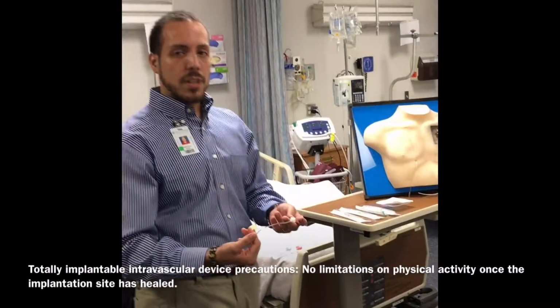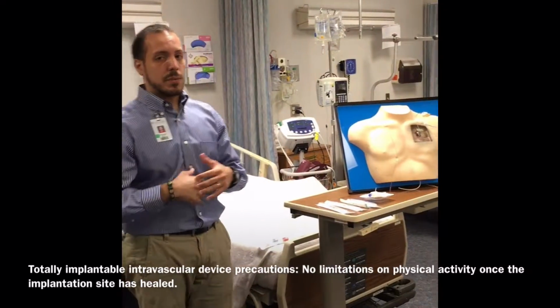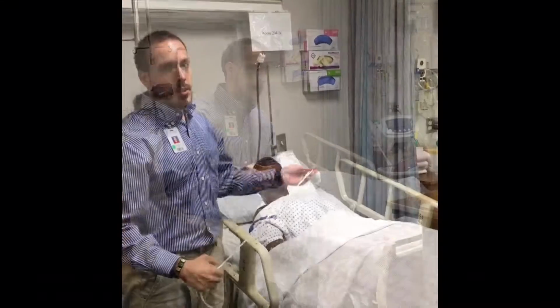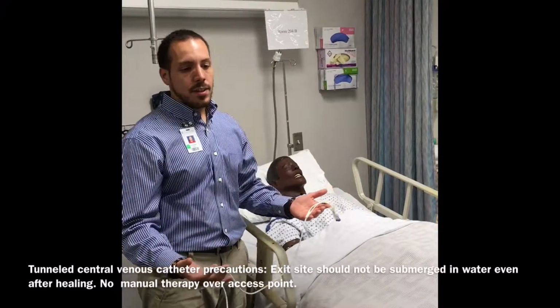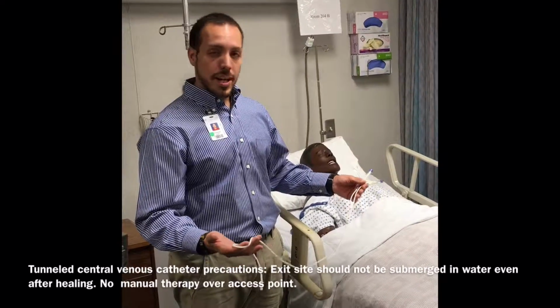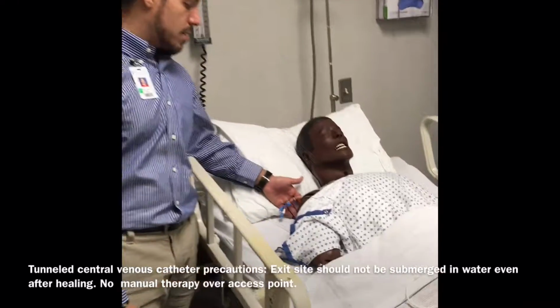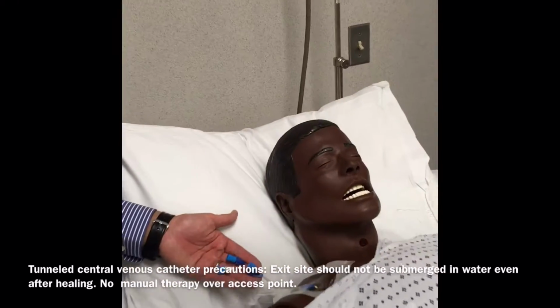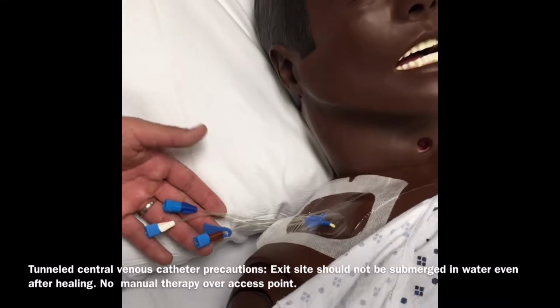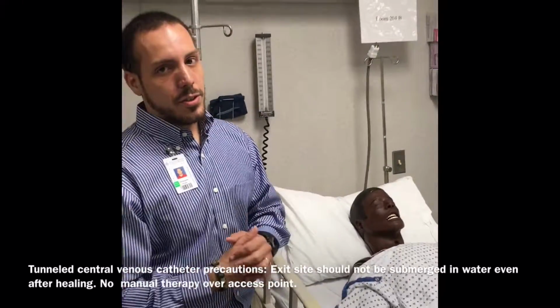Those are going to be totally implanted in the chest. I don't know if you remember from Respiratory's class, but if you see those coming out in any way, we're just going to notify the nurse to get those reinserted. On the patient behind me and in my hand, we have a tunneled central venous catheter, also called a Hickman. As you can see on our patient, it's inserted right here, feeding right into the heart and the veins. Just like any of the catheterizations and IV lines, we never want to take those out, and if we see them coming out, immediately notify the nurses.